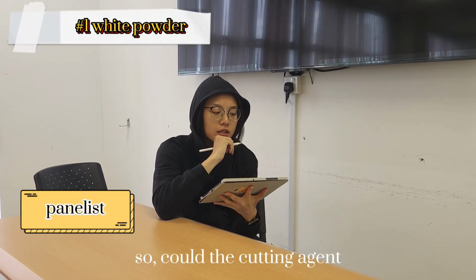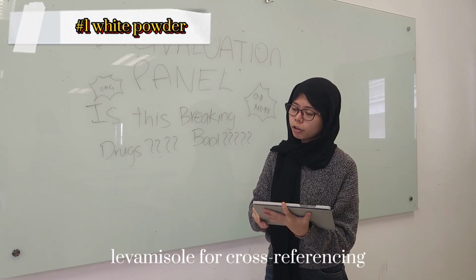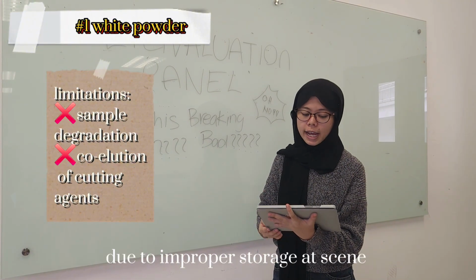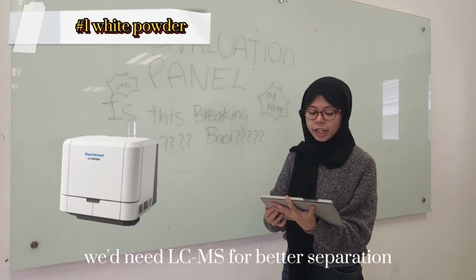Could the cutting agent suggest a specific supplier? Potentially. We flagged the levamisole for cross-referencing with DEA databases. However, limitations include sample degradation due to improper storage at the scene, and co-elution of cutting agents makes quantification difficult. We need LCMS for better separation.